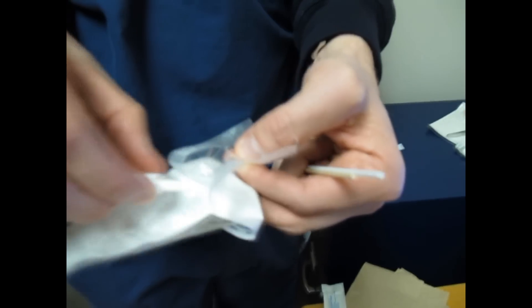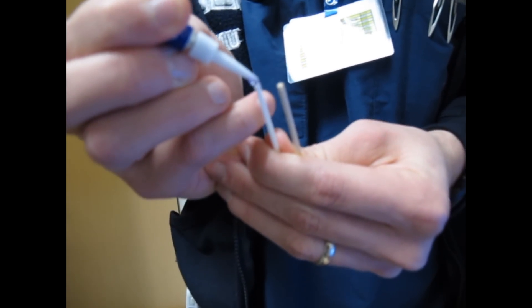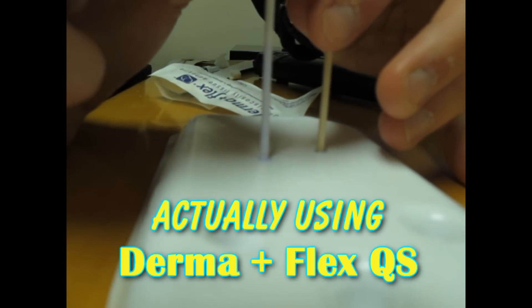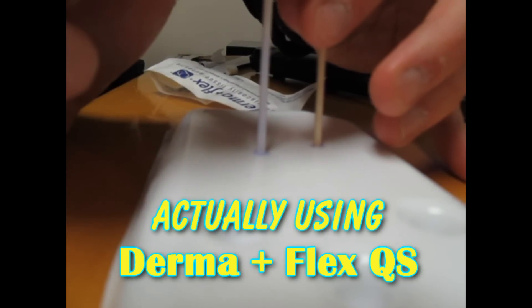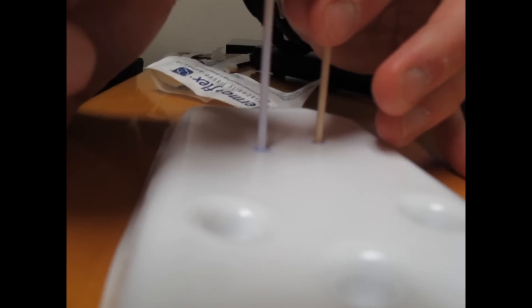So those are your two Q-tips? One issue we may run into is that the plastic one is hollow — it has less surface area. Or it may fill up with Dermabond that would pour out into the ear.